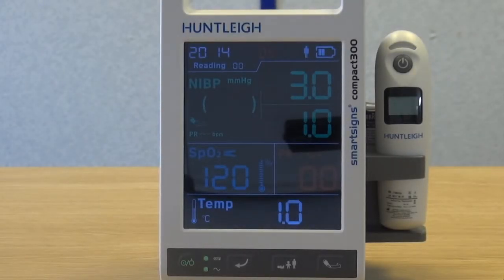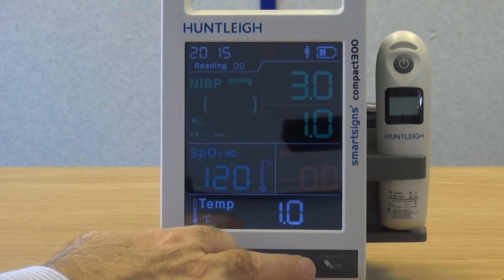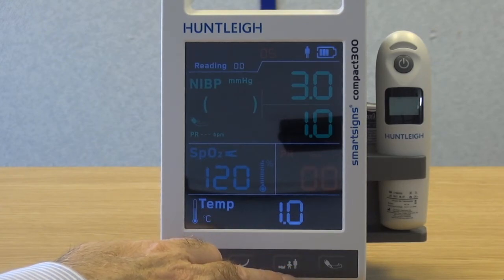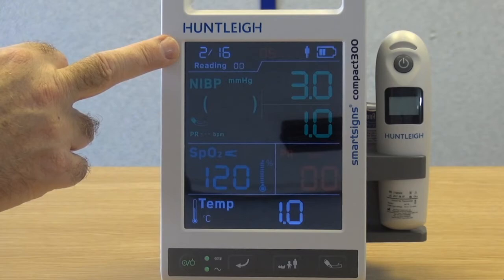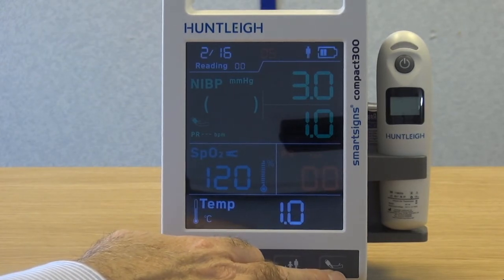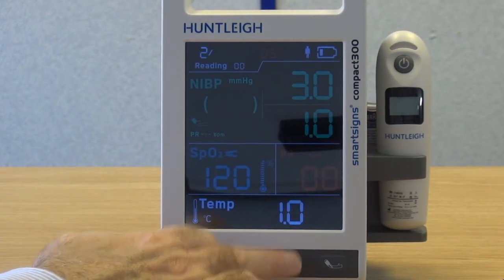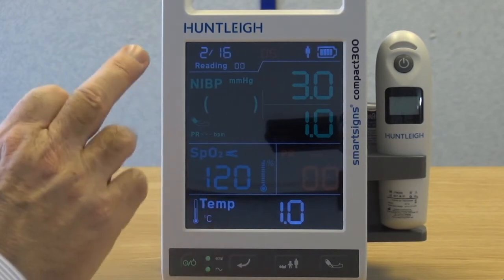The date display will flash. First set the year — press the patient group button to increase the number, or press the start-stop NIBP button to decrease the number. Having set the correct year, press the enter key to advance to the next setting — the month. Press the patient group button to increase or the start-stop NIBP button to decrease. Press the enter key to advance to the day setting. Press the patient group button to increase or the start-stop NIBP button to decrease, then press the enter key to advance.